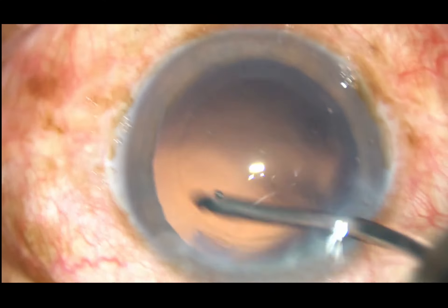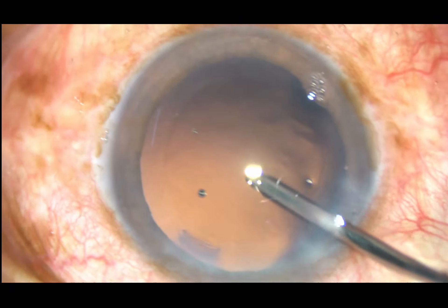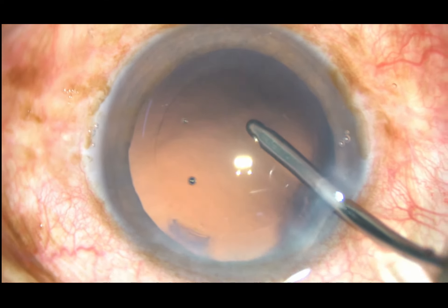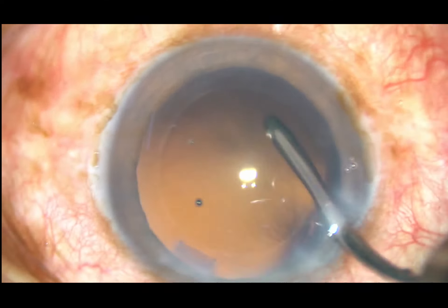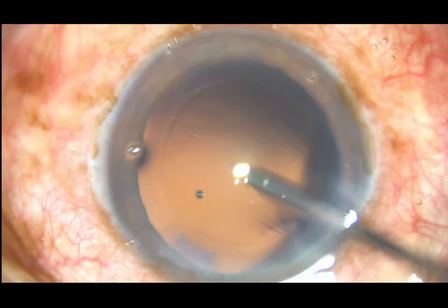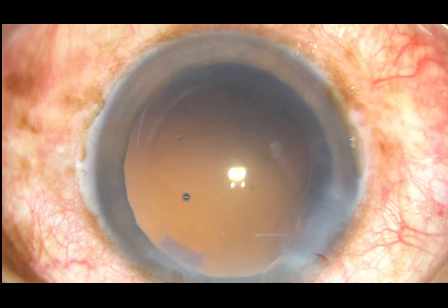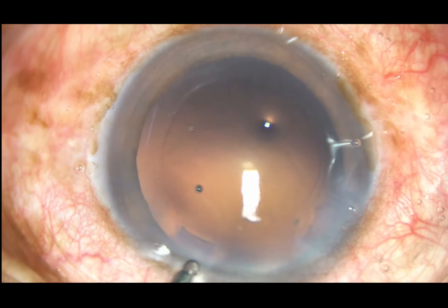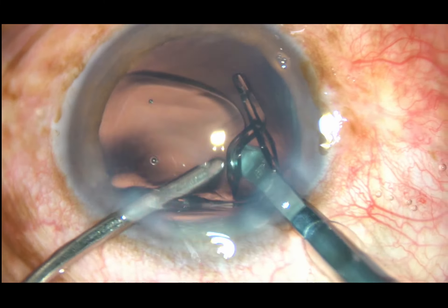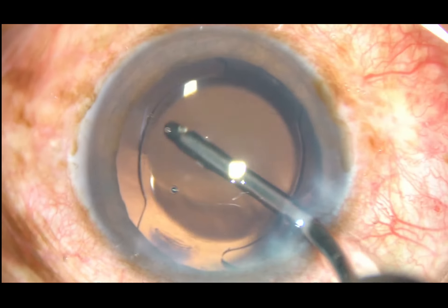This is hydropolish. Now let me recap how to do direct chop: make a crater just in front of the main incision, go at a deeper level, go to position 3, hold the nucleus firmly, come back to position 2, and then chop the nucleus.